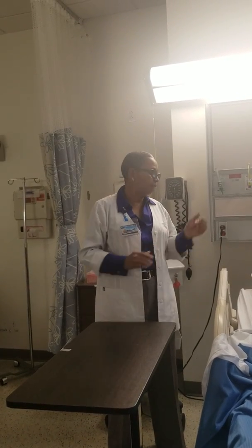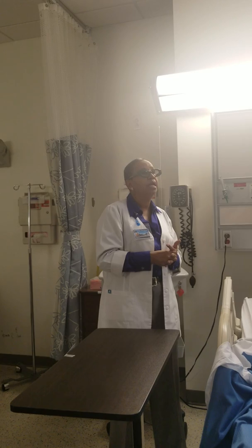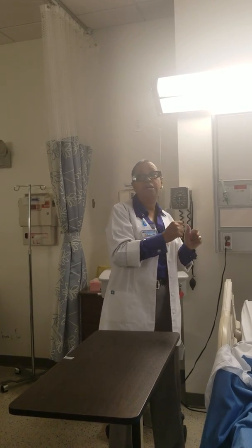I can run anything I want to with it. I don't have to say I can't bolus this. Yes, I can. I can bolus this in one room and turn around and give something else. So yeah, I have a lot more access available to it. But then again, I have opened this patient up to what? Infection. And it's a big one.